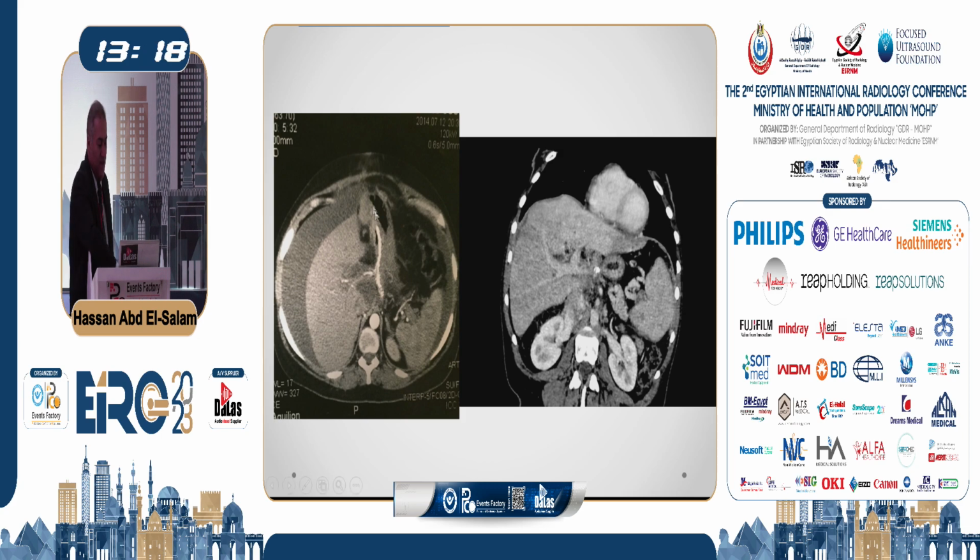You can see here, these are the metal clips of the surgery, very close to the porta hepatis. This was thought to have caused biliary injury. I did PTD and put a biliary drain for her. The ascites was relieved, and then a week later she presented again with ascites. This is the second attack of ascites.